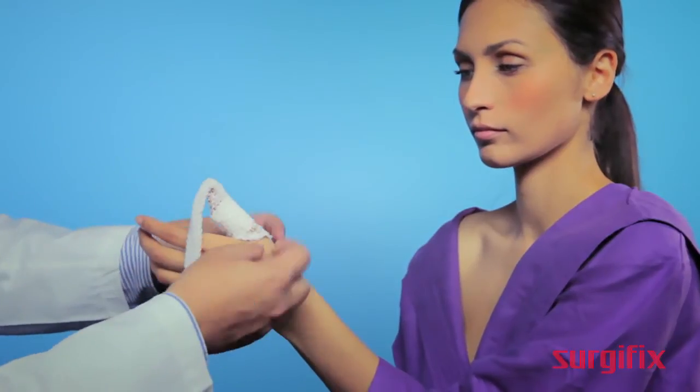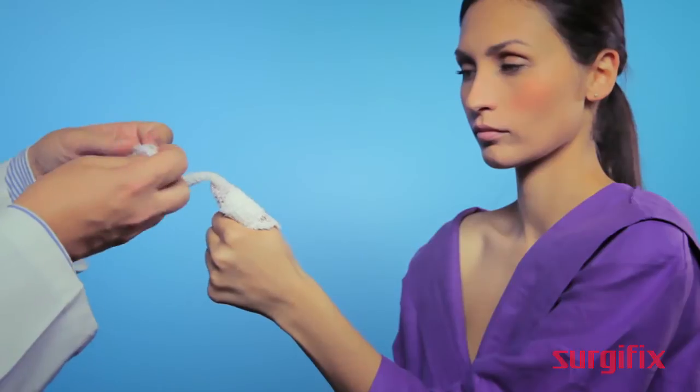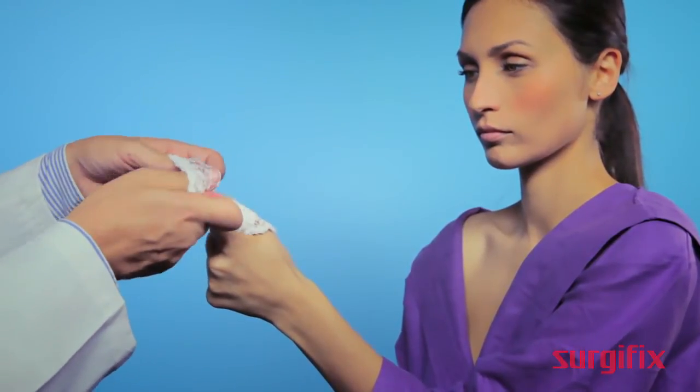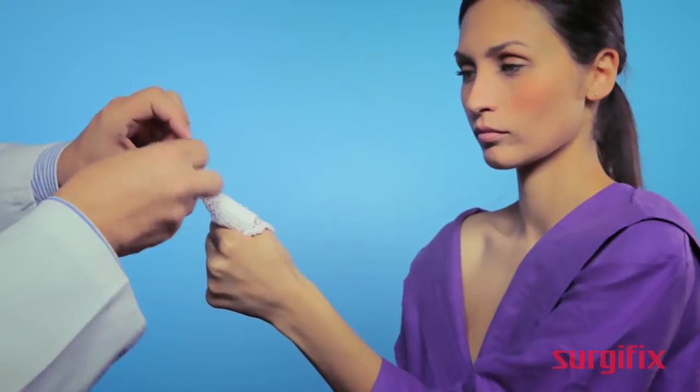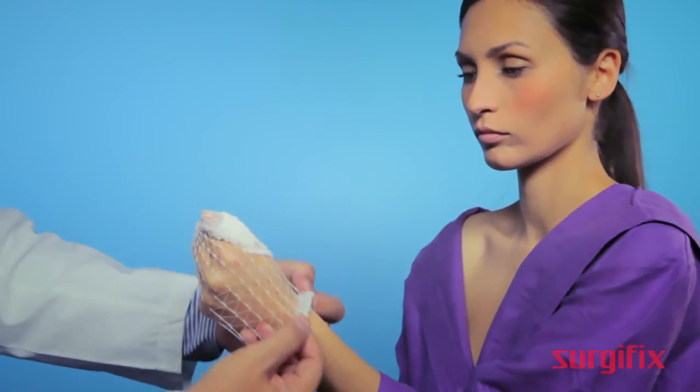Apply the first layer to the thumb. Rub the product around the thumb 3 or 4 times, and then apply the product to the entire outstretched hand.